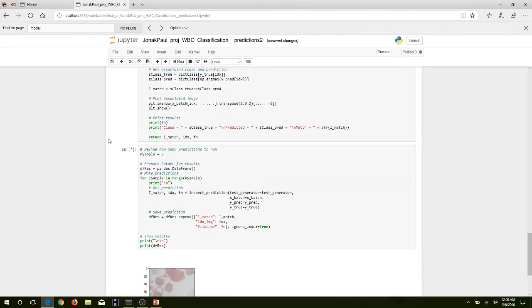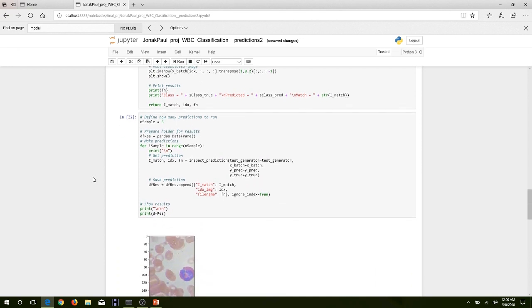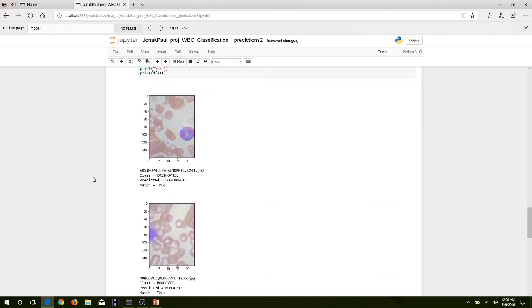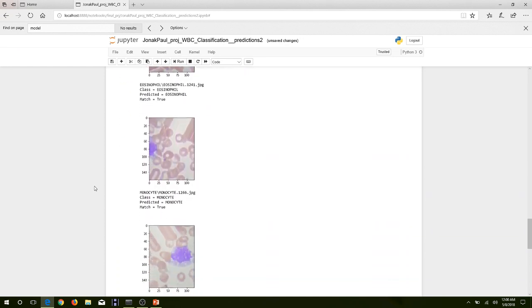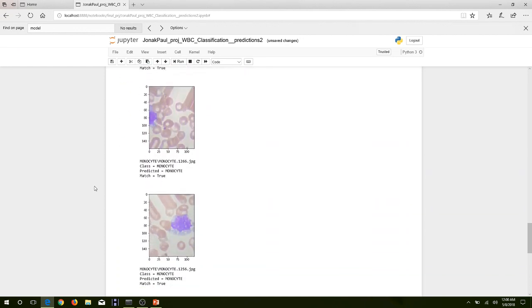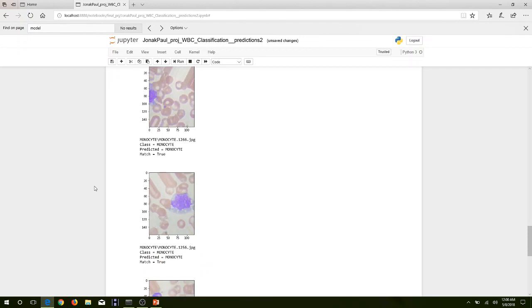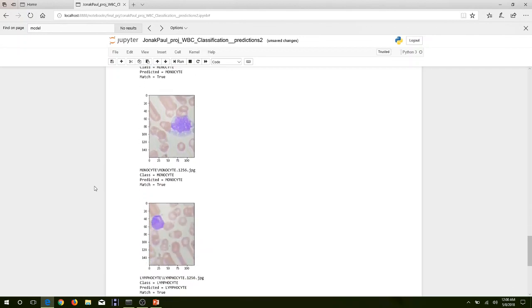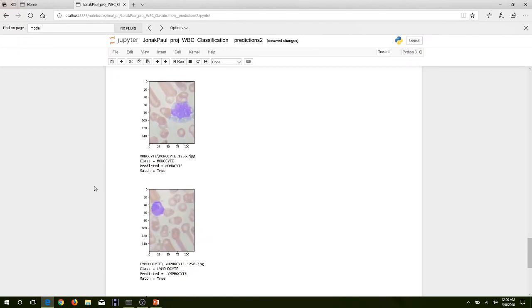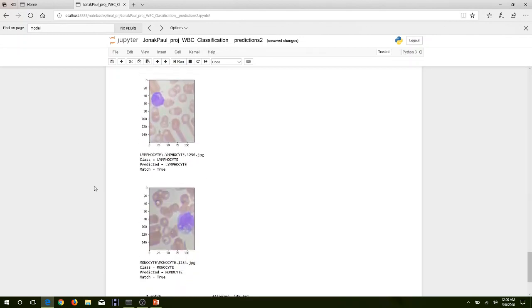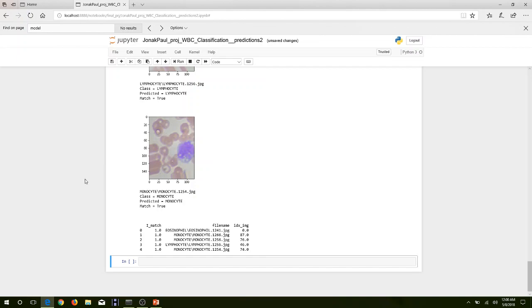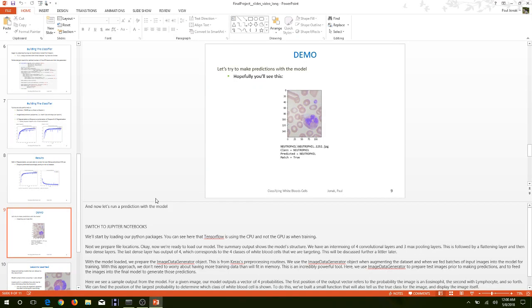Running the visualization again on another set of five random samples: eosinophil predicted as eosinophil, monocyte as monocyte, monocyte as monocyte, lymphocyte as lymphocyte, and monocyte as monocyte — all correct. Let's get back to the presentation.